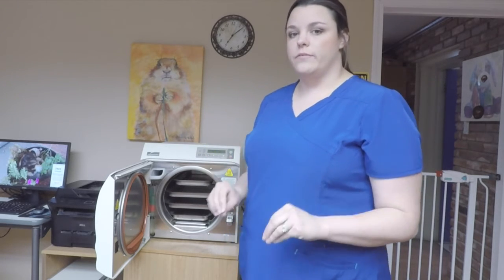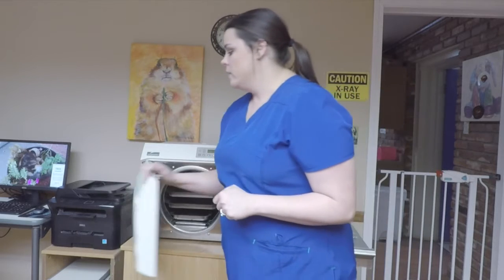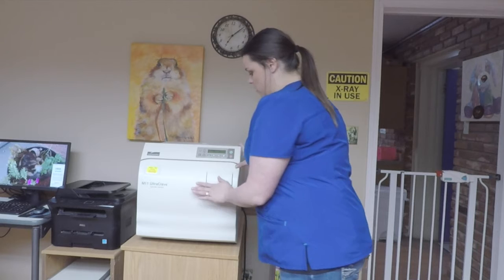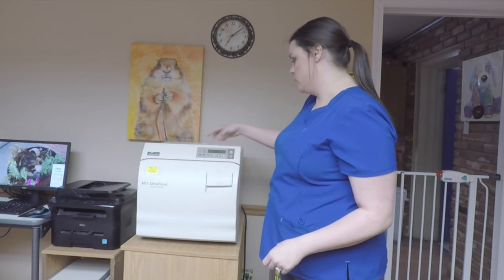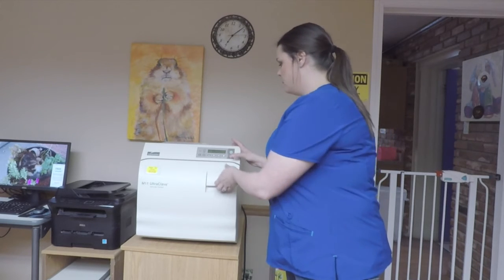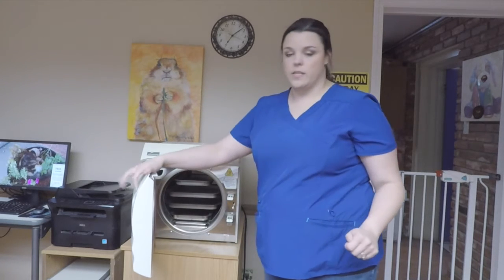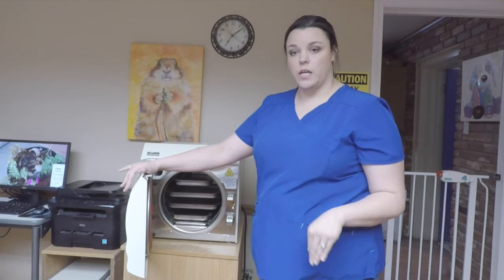Autoclave. An autoclave works by the temperature rising and the pressure changing to make a penetrating steam that kills the bacteria that were left on the packs. Ours is pretty simple to use. You just close the door and then you select what you want and hit start. And then it will do its thing and release the door when it is done.